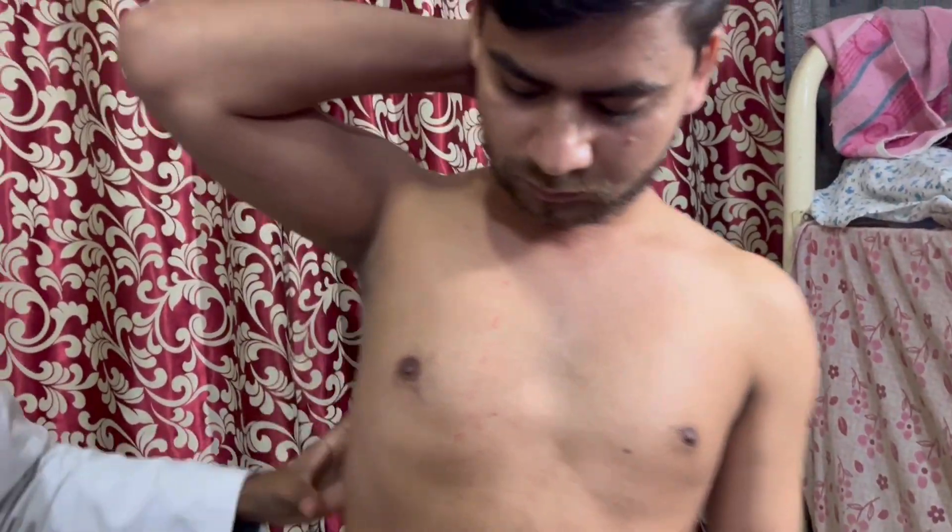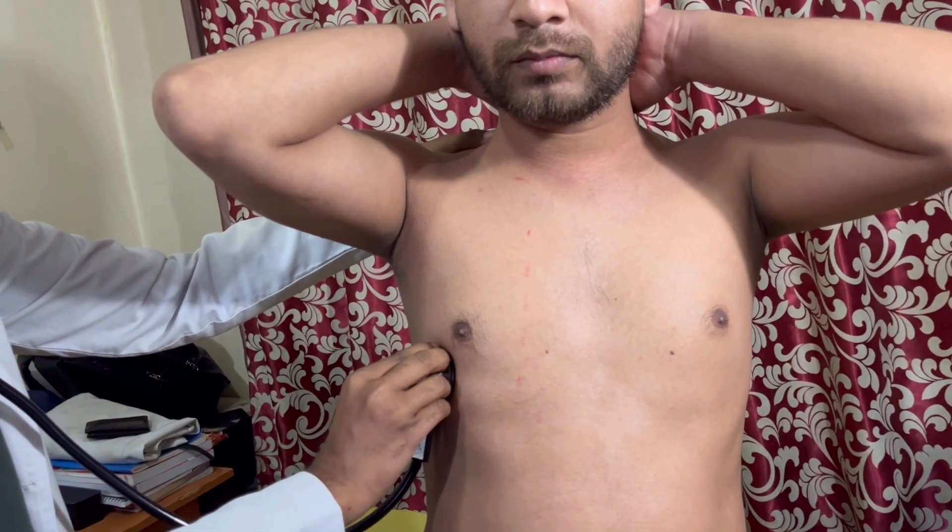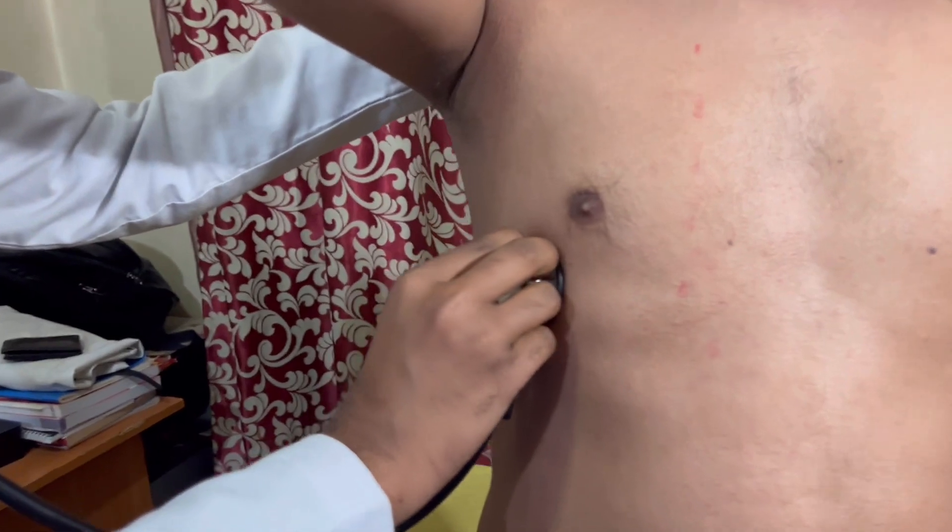We auscultate along three lines: the anterior axillary line, the mid-axillary line, and the posterior axillary line. First, we auscultate the fourth and fifth intercostal spaces along the anterior axillary line.